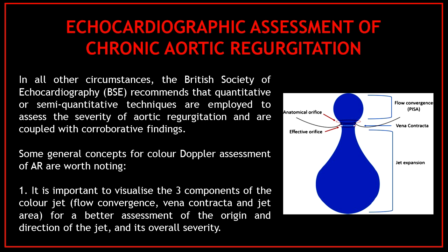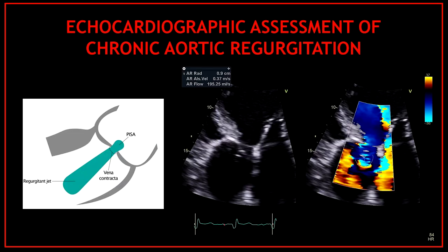Some general concepts for color Doppler assessment of aortic regurgitation are worth noting. First, it is important to visualize the three components of the color jet: flow convergence, vena contracta, and jet area, for a better assessment of the origin and direction of the jet. Here in these pictures is an example of the three components: first the flow convergence zone, followed by the vena contracta, and then the regurgitant jet area.